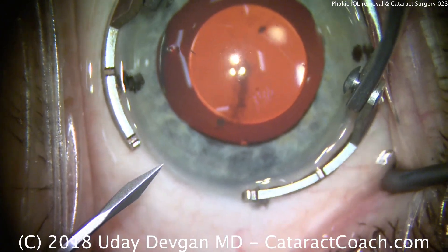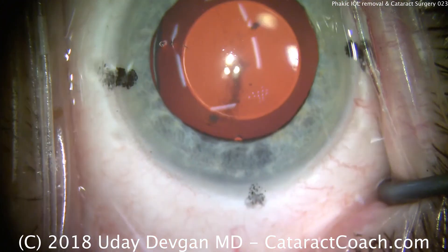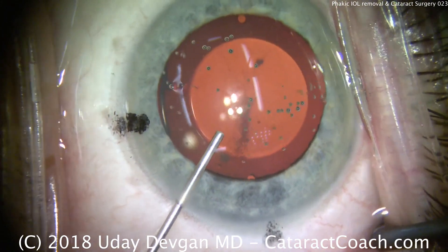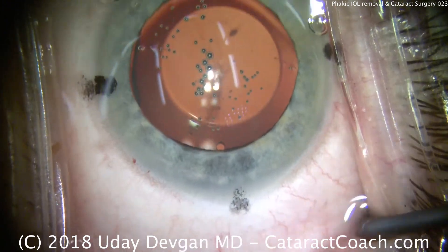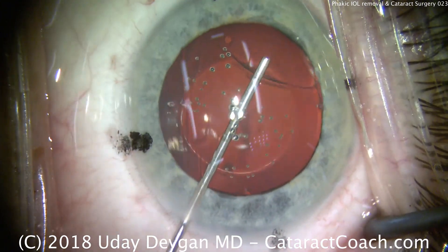CataractCoach.com presents a cataract surgery combined with removal of a posterior chamber phakic IOL. About 10 years ago, this patient had an implantation of the phakic IOL for treatment of high myopia. It served him well for a while, but recently the patient developed an anterior subcapsular cataract as the phakic IOL touched the anterior lens capsule.